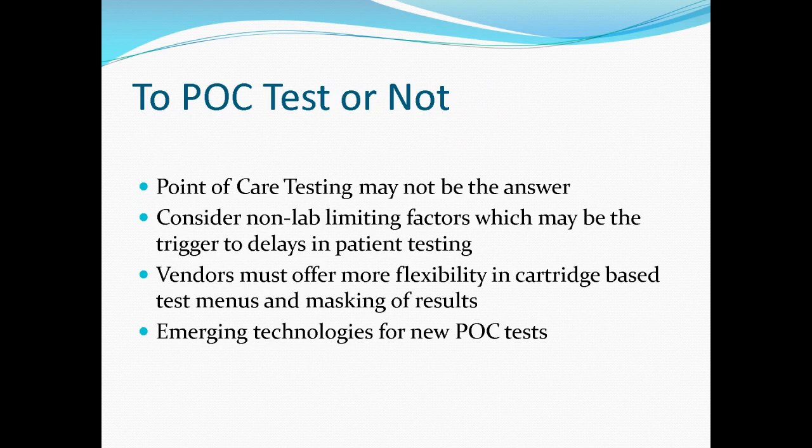Just keep a few things in mind. Point-of-care testing may not always be the answer. Consider non-lab limiting factors which may be triggers to delays in patient testing. And also, vendors may not offer flexibility in regards to cartridge-based test menus.